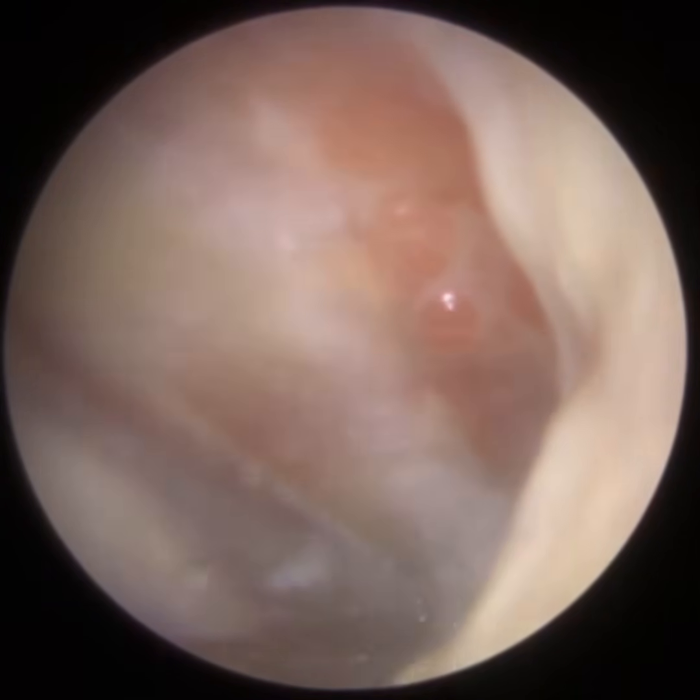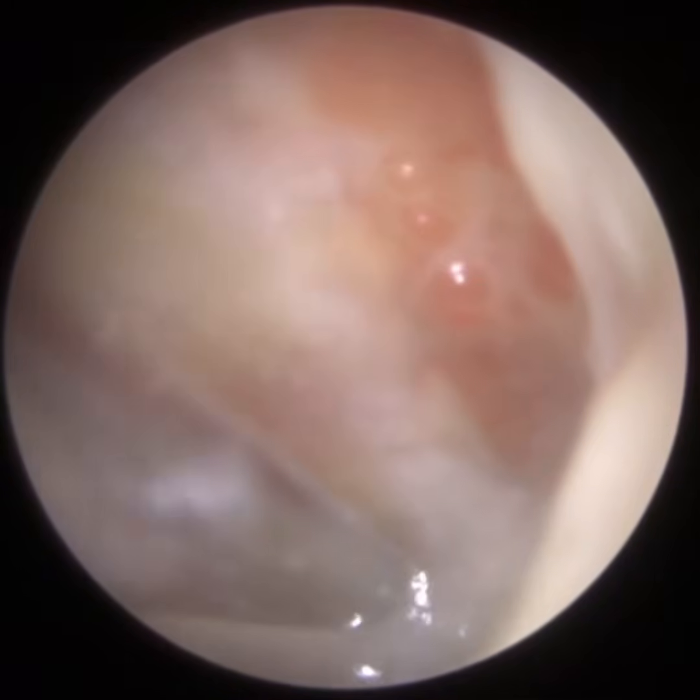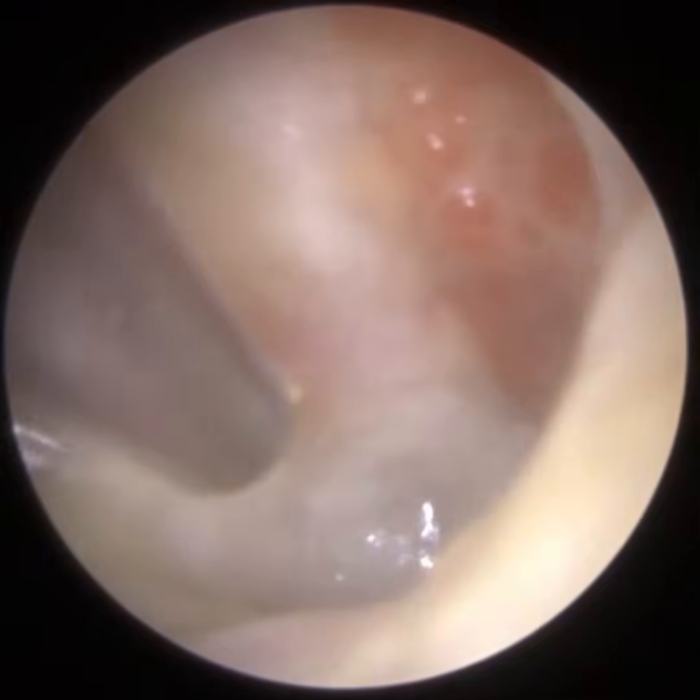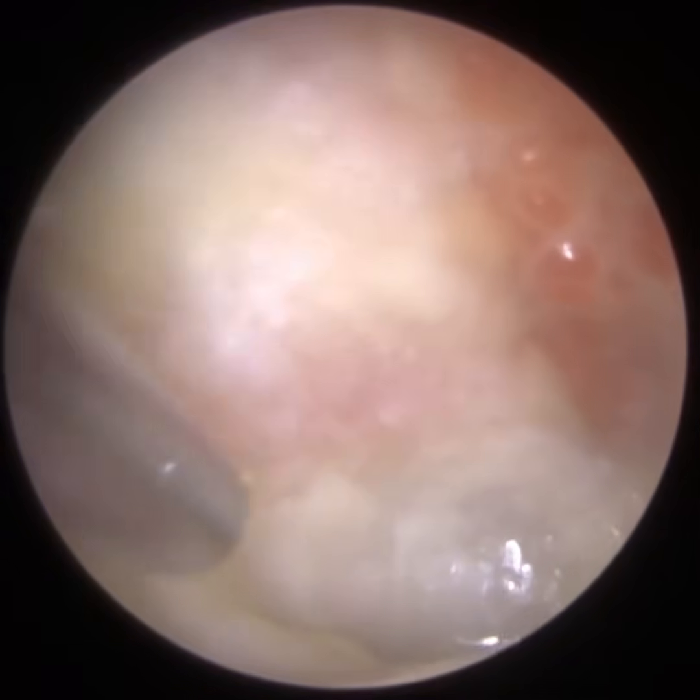Just working very closely on the eardrum. The eardrum's still very damp and wet. We do have to be very, very gentle when we're working this close to the eardrum. The eardrum is very delicate. It's 0.1 millimeters in thickness.